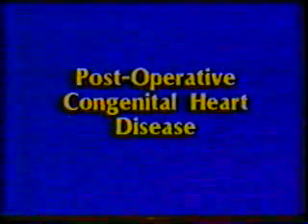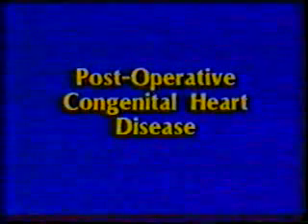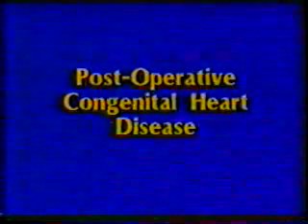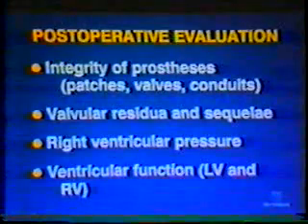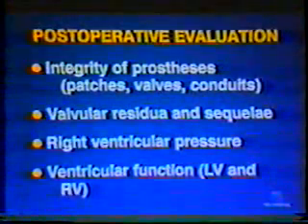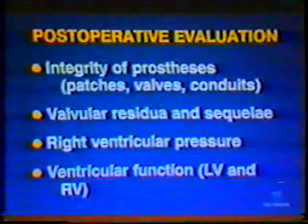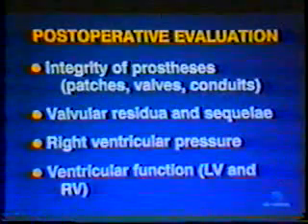We will now turn our attention to the post-operative congenital cardiac patient. These patients represent a great challenge to the echocardiographers. The examiner must be thoroughly familiar with the type and nature of the operative procedure and with the expected appearance as well as the long-term complications.